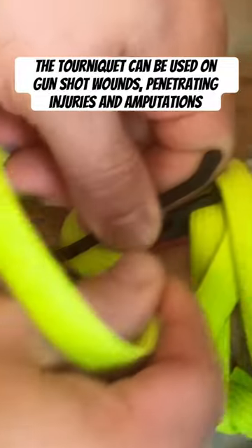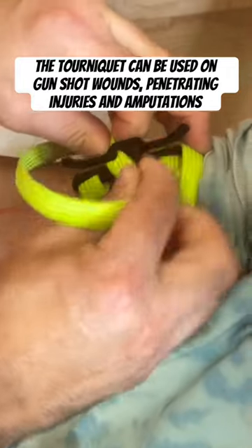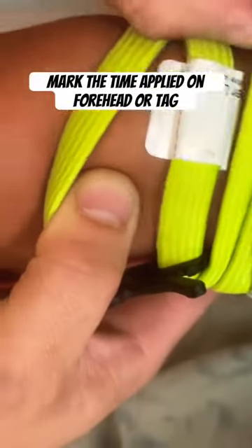Secure it under here, and we're going to mark the time right here.